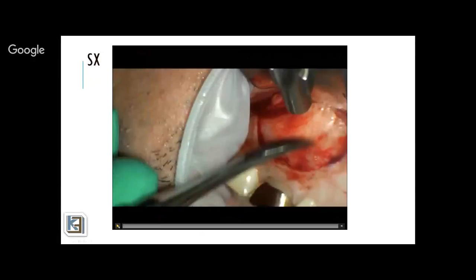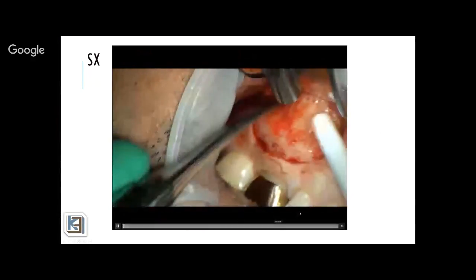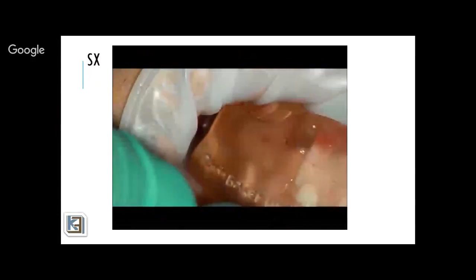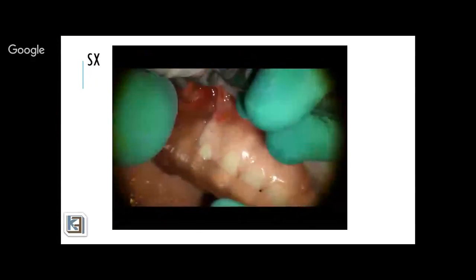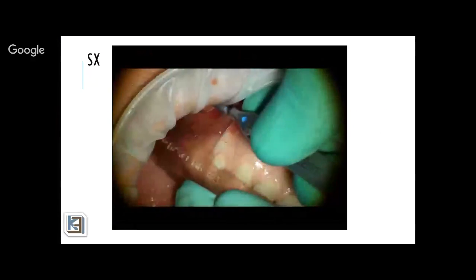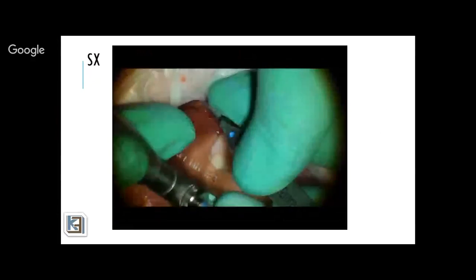Now, I wanted to show you another video for apical surgery. This one is being played at very high pace. I hope you enjoy it. So this is my flap, my retraction. I'm sliding in my guide, and you can appreciate the fact why you have to take your impression all the way up to the mucobuccal fold. In this case, I used the Straumann guided surgical kit.